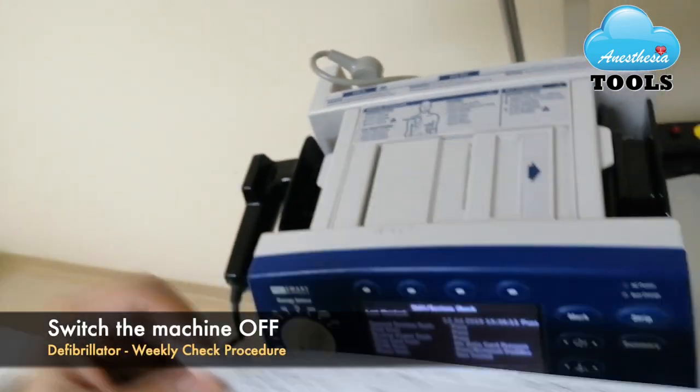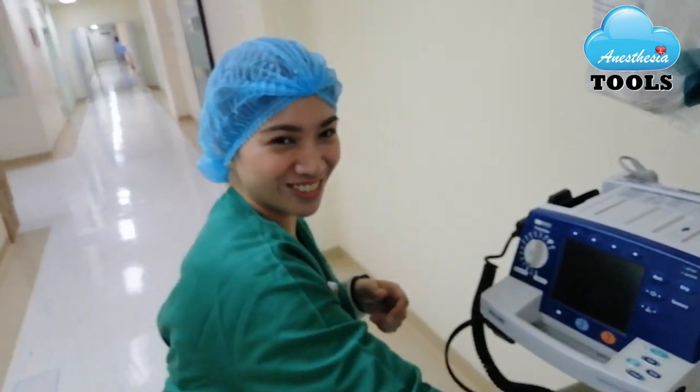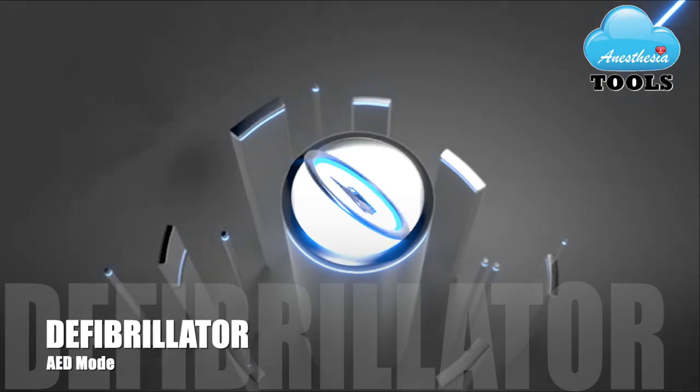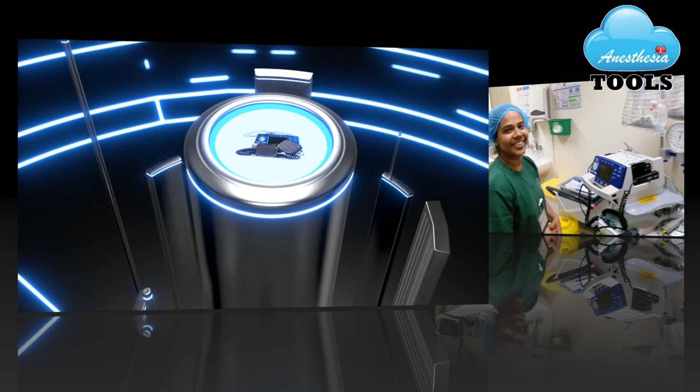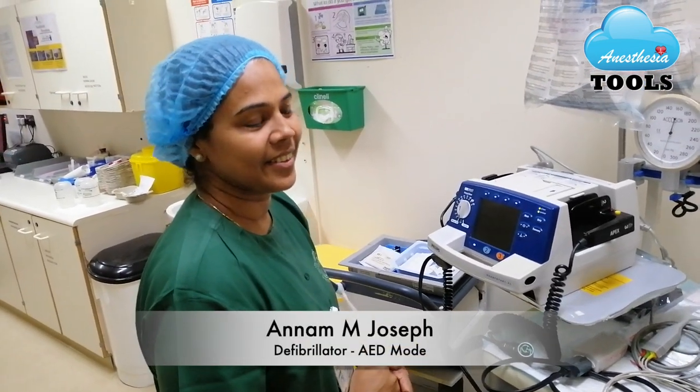This is our strip for the weekly paddle checking. She will be removing the strip and switch off the machine. Thank you, Dianne, for your cooperation. Now Annam is going to show us how to use the CPR Defib AED.